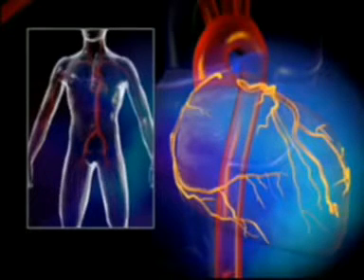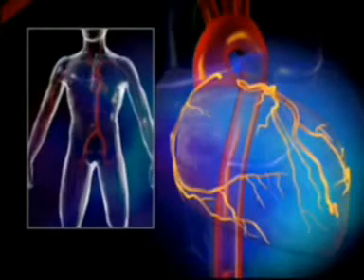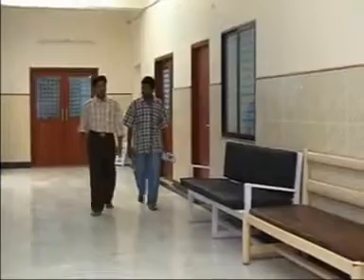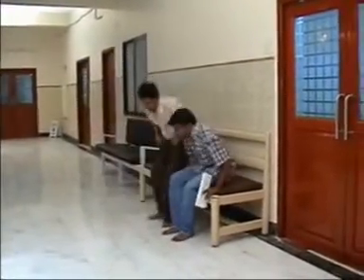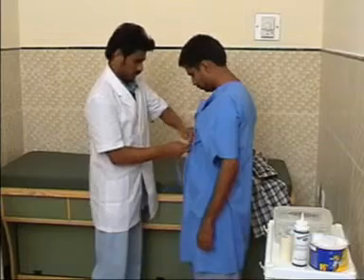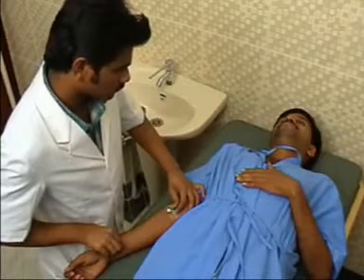CT angiography is preferred to MR angiography in the present scenario. In this advanced technology procedure, the patient walks into the facility of the multi-detector CT scan, bears the preparatory dress, and is cannulated with a 20-gauge intravenous line.